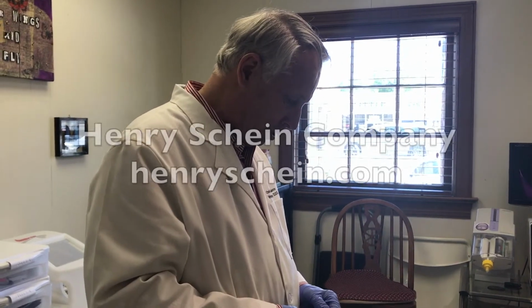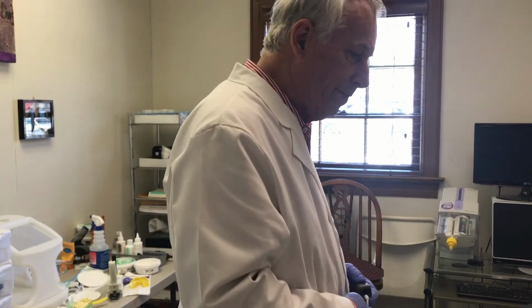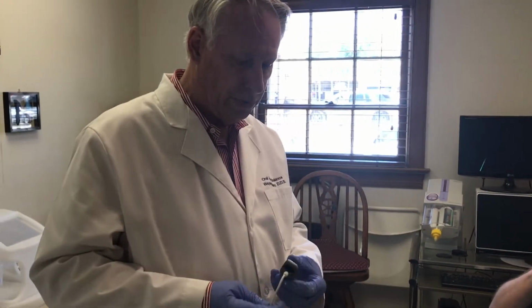If we get these from Shine. Can I take this off to do? Yeah, it seems like that would be counterproductive. We don't put this pulse oximetry on the finger that we do the blood pressure, so that when we put the blood pressure up, it doesn't look like the patient quit breathing on us.